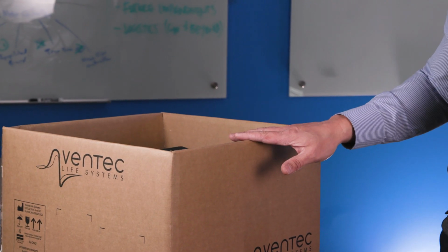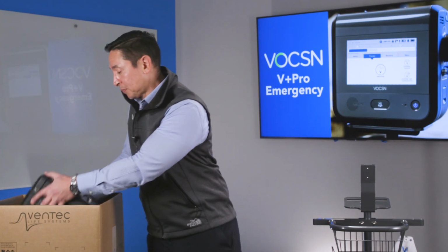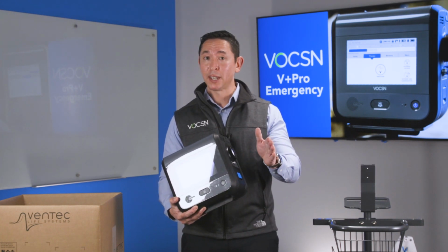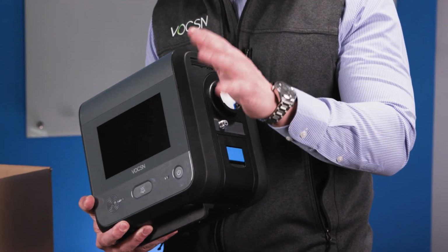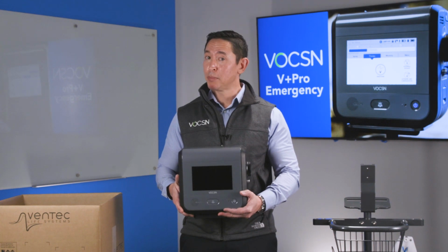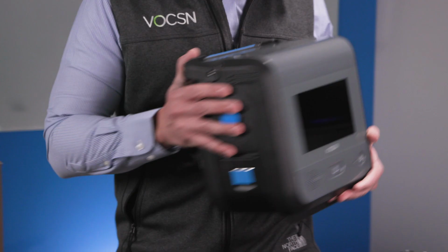Let's take a look at what comes inside the box. The first thing I'm gonna grab out is my VOCSN V+Pro Emergency. Now, I happen to have a roll stand right here. You may have a roll stand or you may have a bedside table. Use whatever you have in the environment that you're currently working in. VOCSN V+Pro is designed to come out of the box so that once I put the patient's circuit on and turn on power, you'll automatically start ventilation.